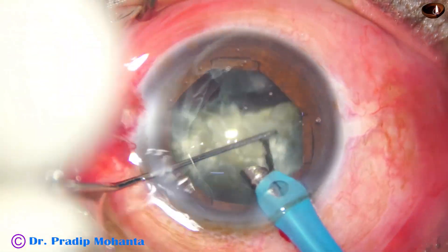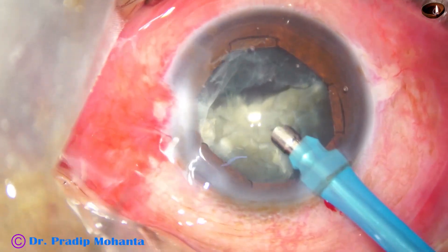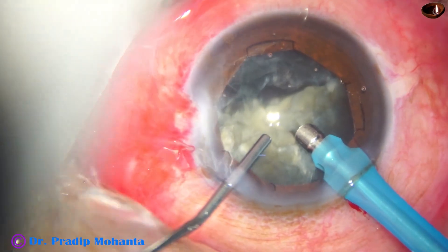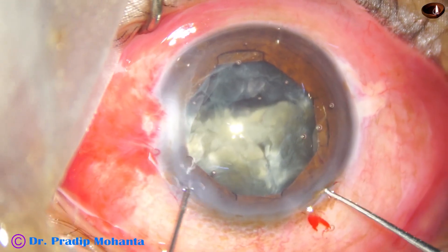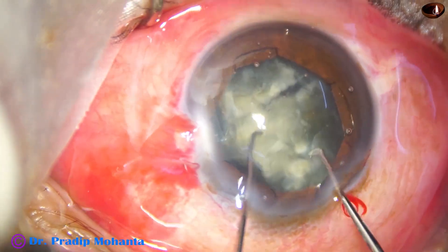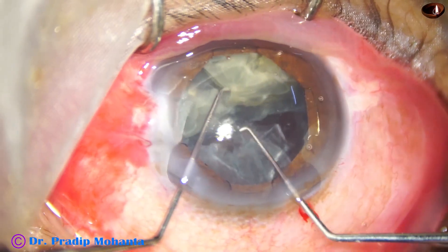Almost one heminucleus has been removed. Now we come to the second heminucleus, and the crack is not complete here — there are some attachments. I am finding it difficult, so I am asking my assistant to inject visco, stop irrigation, inject visco, keep the anterior chamber formed, and then come out. Otherwise the anterior chamber will be shallow and there will be zonular stress — the bag will tend to come near the cornea and the zonules will be stressed. So I form the anterior chamber with visco, come out, and rotate the piece into a manageable position.